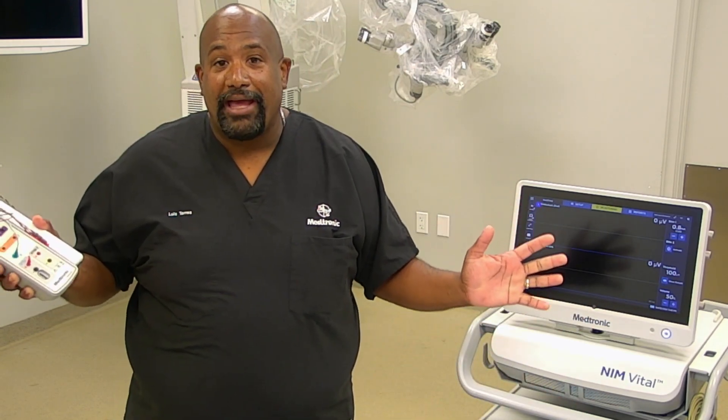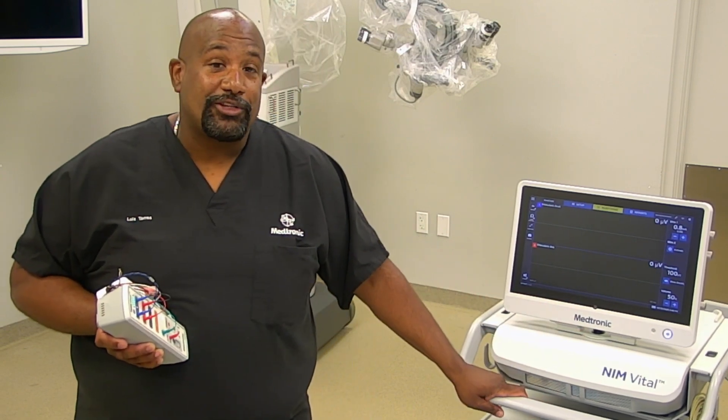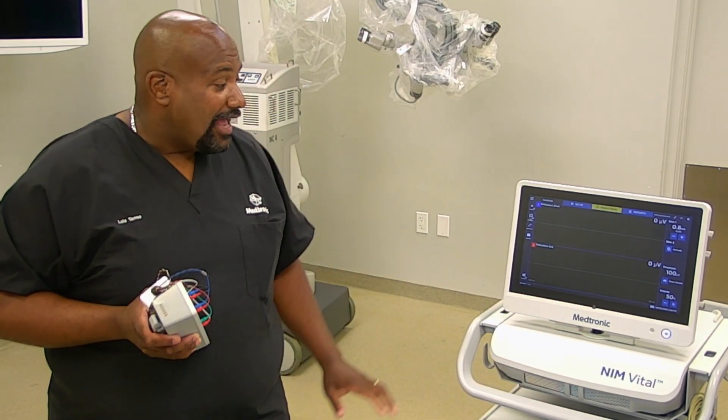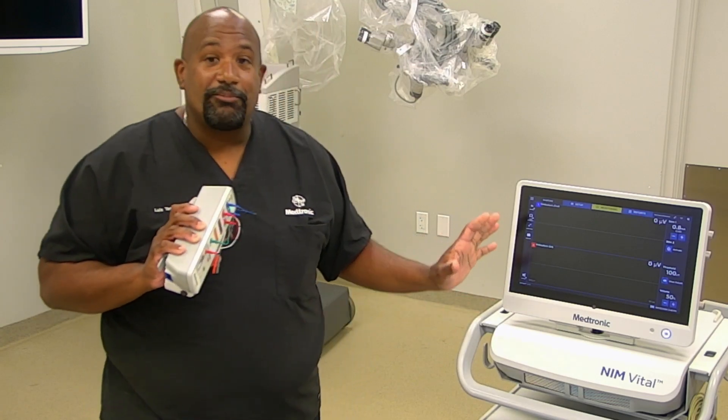Your NIM wants to be located somewhere either at the head or the foot of the bed, away from any other electrical equipment. If you can have it powered into its own outlet, that's perfect.